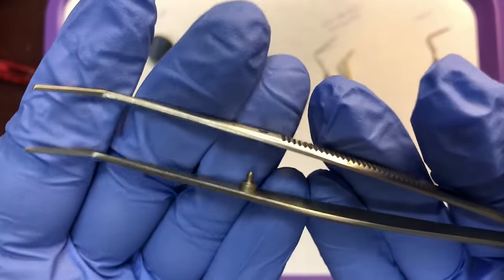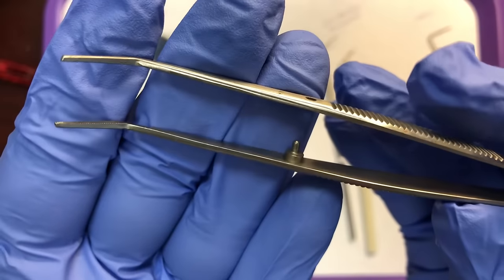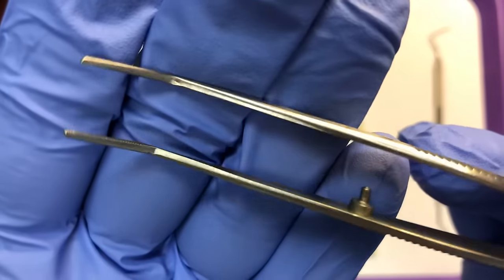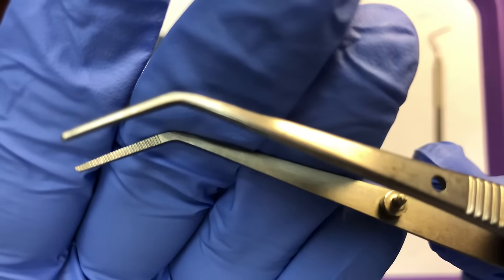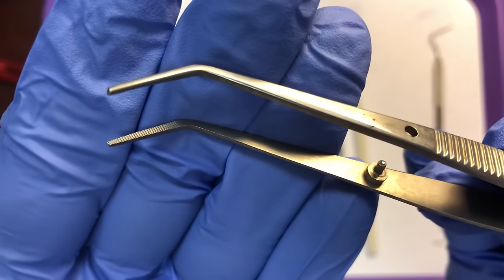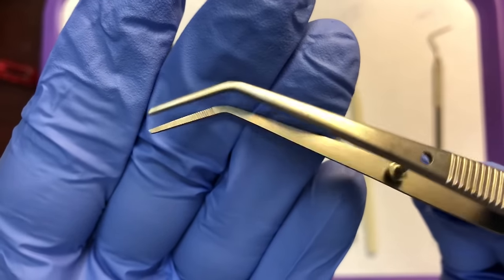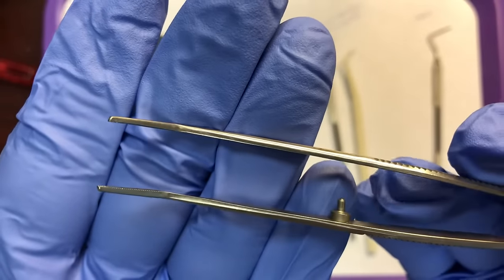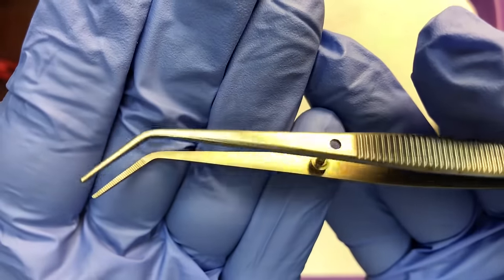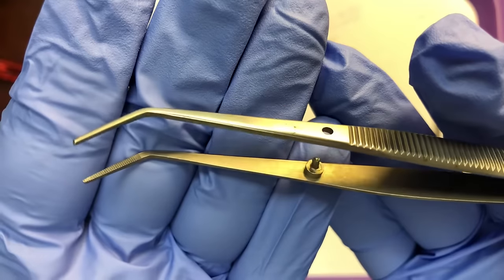Next up is the cotton pliers. This is a non-locking cotton plier — some cotton pliers can close and stay closed, but this one opens up as soon as you relax your grip. Notice the tips are serrated so it can grip objects more easily. The purpose of cotton pliers is to transfer small objects in and out of the mouth — cotton pellets, wedges, matrix bands — since it's hard to grip such small items with your fingers.